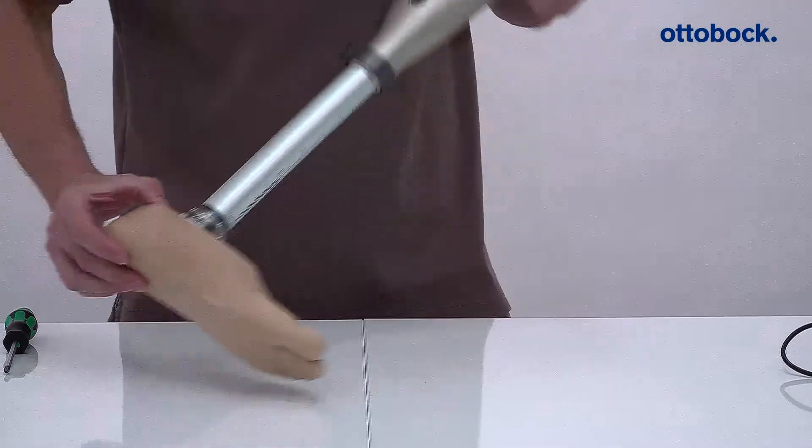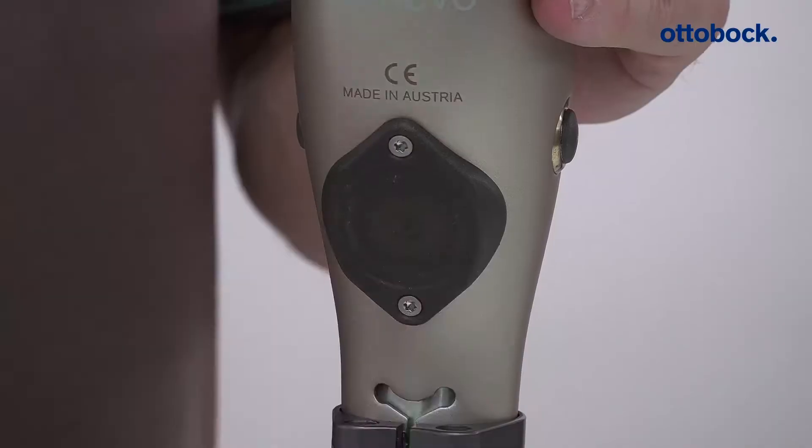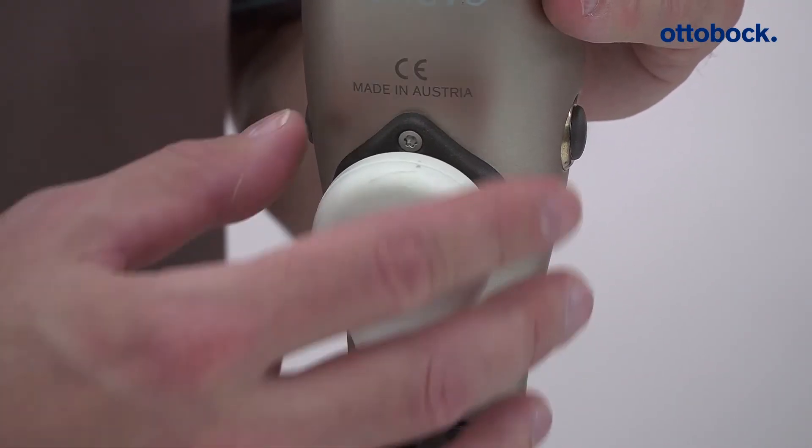Switch the knee joint off by connecting the battery charger with the joint and removing it again three times. A falling tone sequence confirms the joint has been successfully switched off.